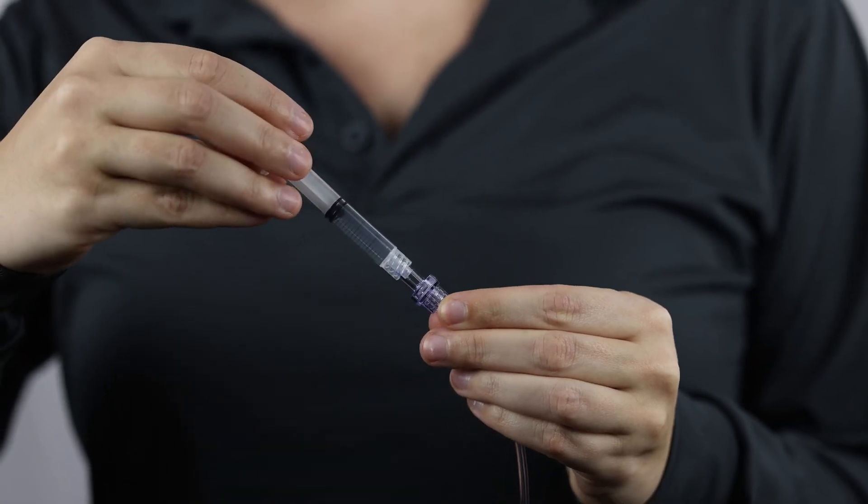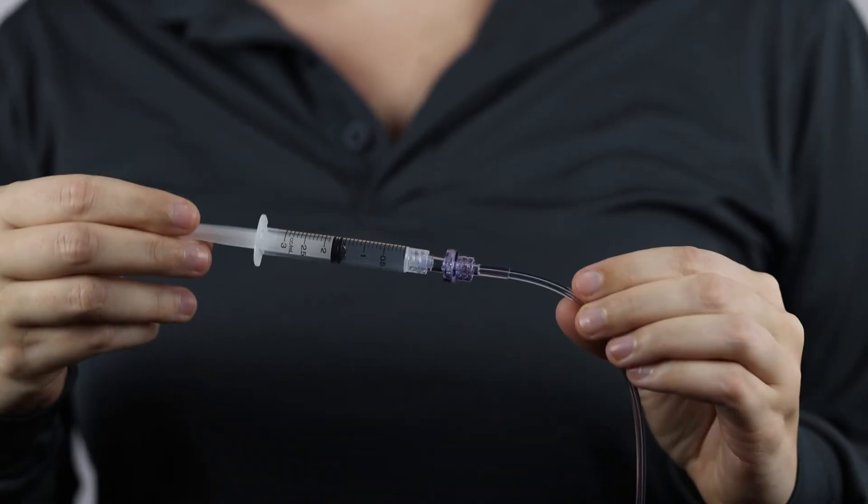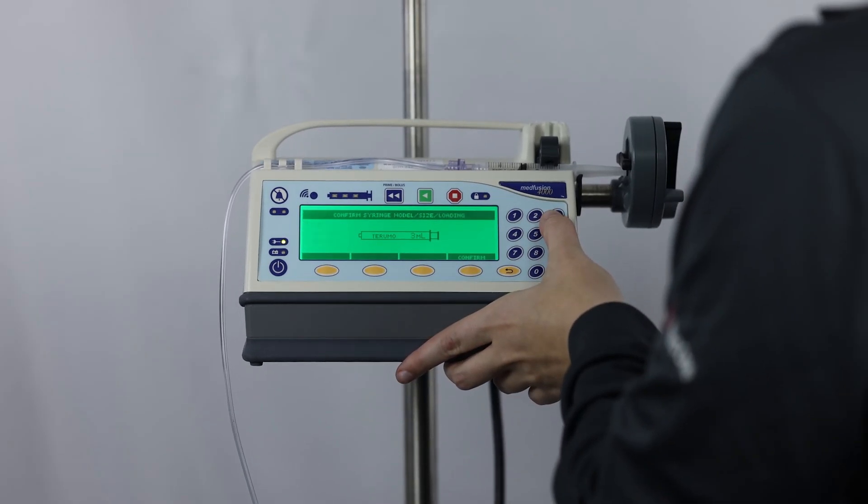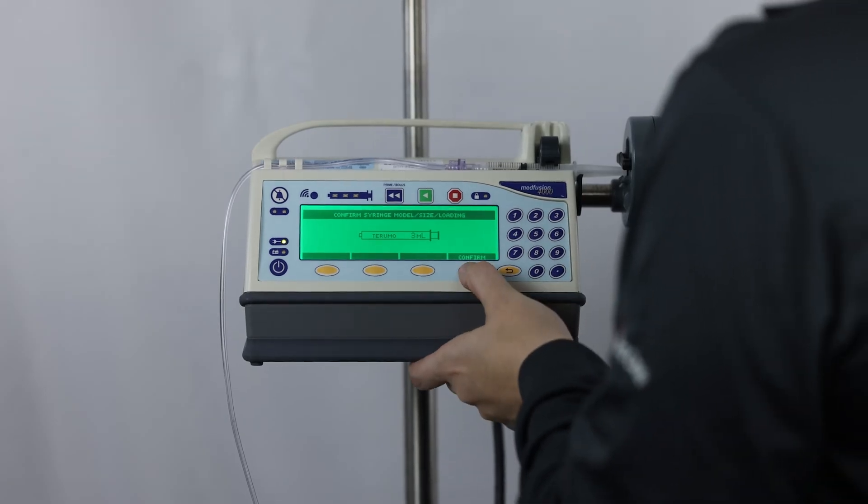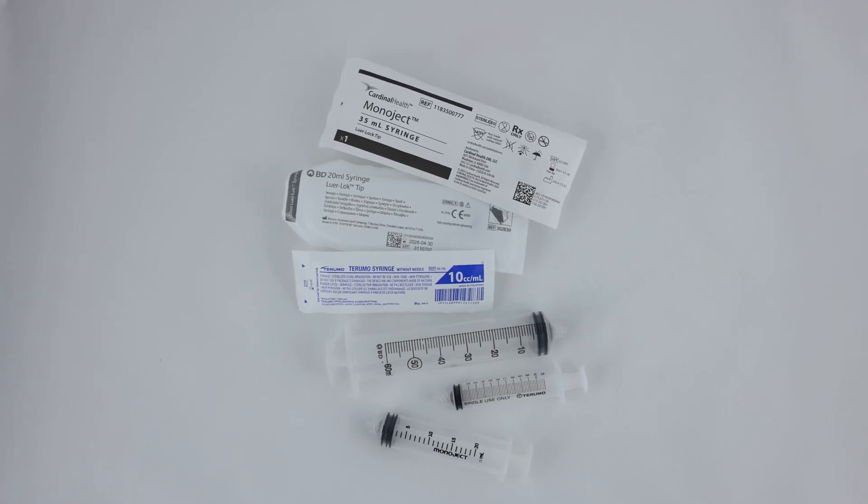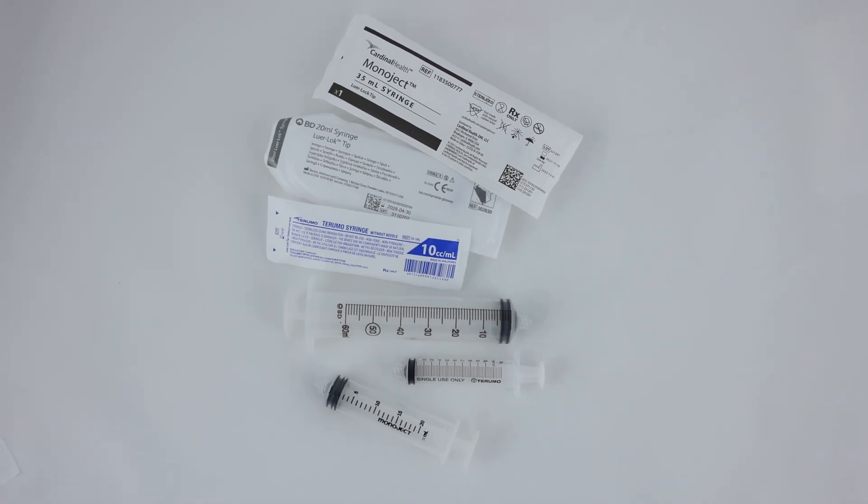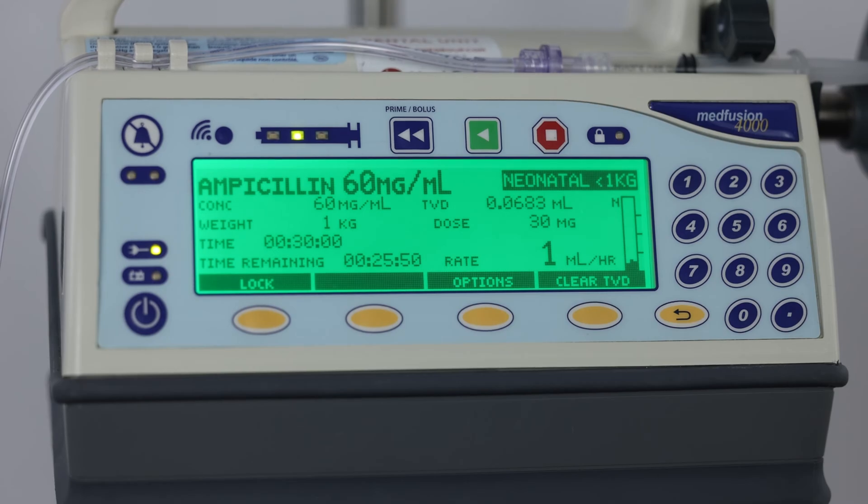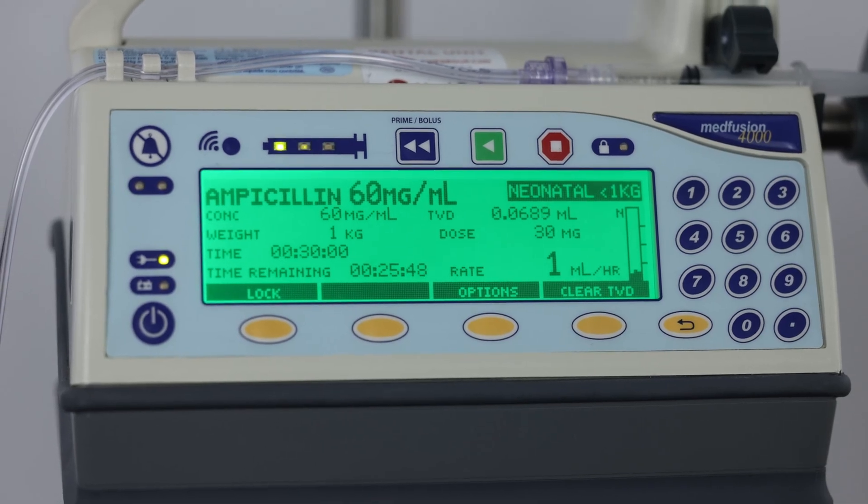Syringes compatible with the Medfusion syringe pump will have a luer lock connector, and the pump will auto-detect various types and sizes, ranging from 1 milliliter to 60 milliliters. Acceptable manufacturers include BD, Monoject, Terumo, and B. Braun. The flow rate range for the Medfusion 4000 is 0.01 to 1130 milliliters per hour.